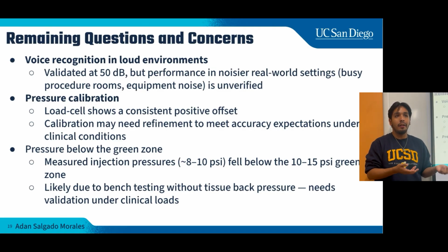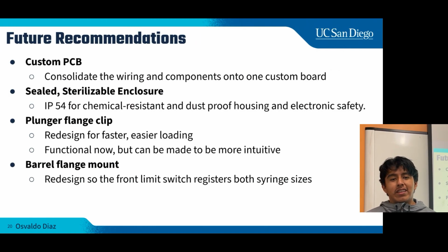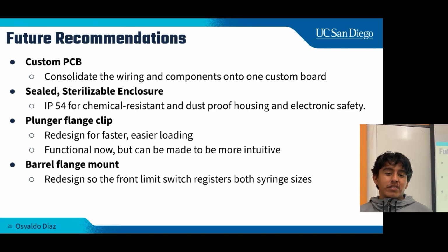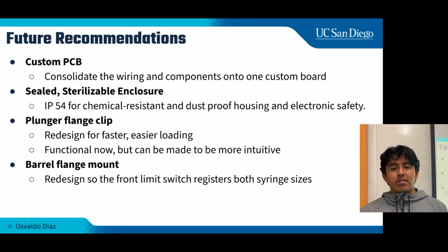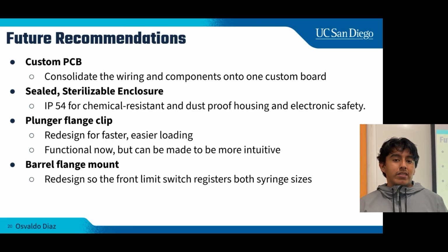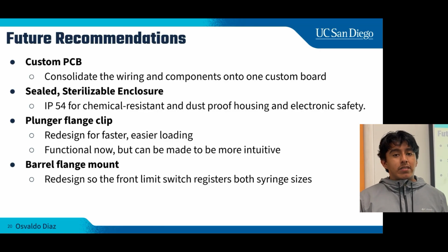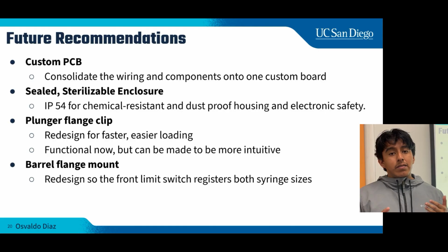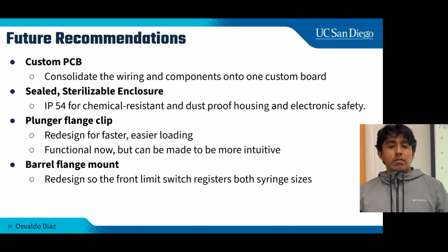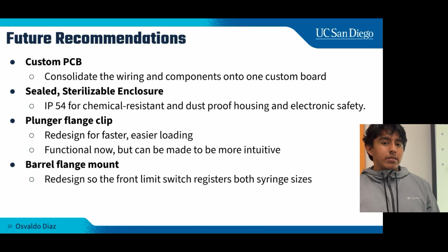So for future recommendations, we suggest getting a custom PCB to consolidate the electronics onto one board. Another suggestion is to get a sealed and sterilizable enclosure to prevent water or any other liquid ingressing into the electronics and making it easier for the doctors to sterilize the overall device. Another suggestion is to make the syringe mounting more intuitive so that it's also easier and quicker to mount the syringes.